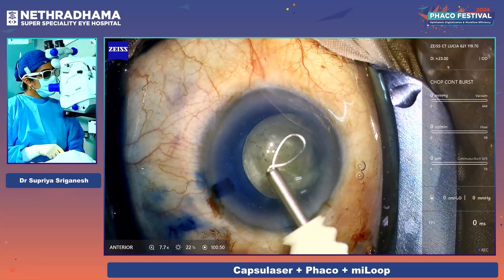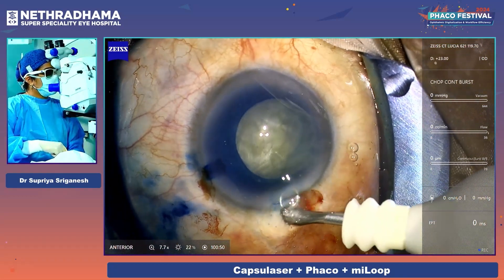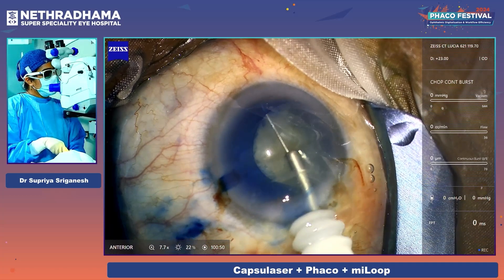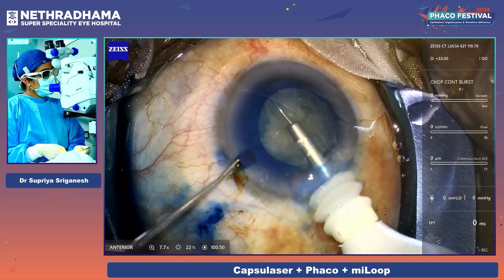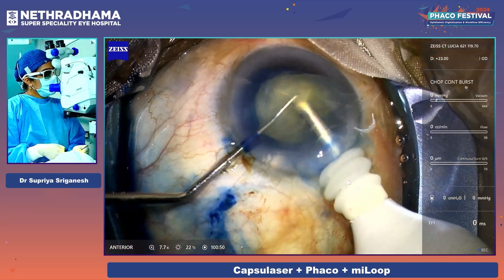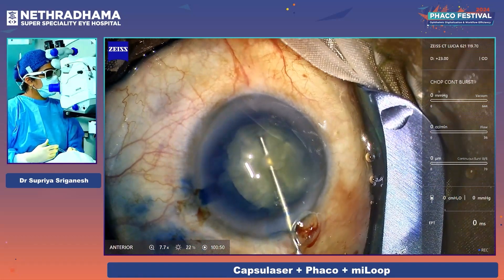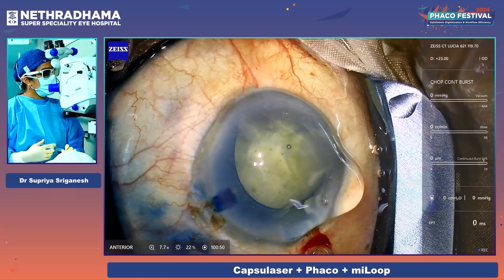I'm going to be using the Milu — this is a nitinol loop. It has a sliding actuation button which we slide. Just inserted the Milu. It's important to get a good hydrodissection so that there is a plane. The loop opens up to 10.5 mm — you open it up under the capsule. You can see the silvery reflex. Just using a second instrument to stabilize the nucleus. It's quite a soft intumescent lens. One cut is adequate for such cases because it cheese-wires. We have bisected the nucleus into two hemi-nuclei.